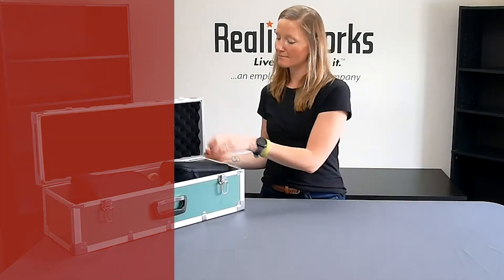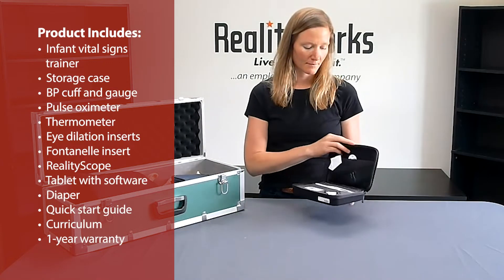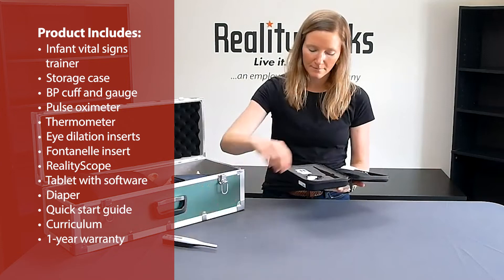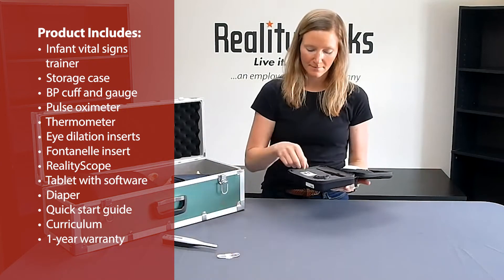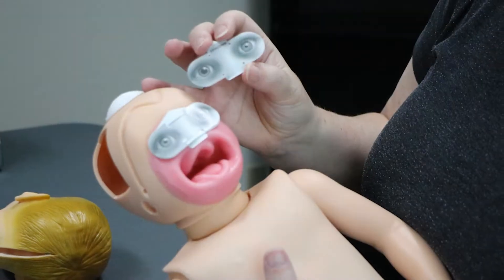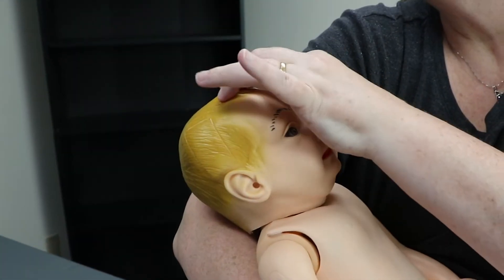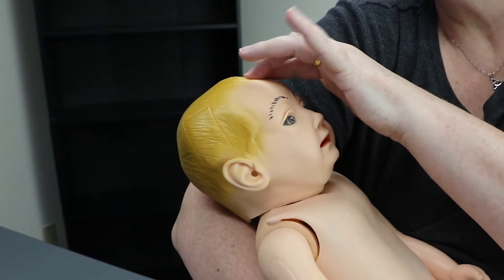To make scenarios more realistic, our Infant Vital Signs Trainer includes several tools for conducting newborn physical assessments, like a blood pressure cuff and gauge, a pulse oximeter, and a thermometer. Students can use the included eye dilation add-ons and bulging fontanelle insert to further challenge their newborn assessment skills.